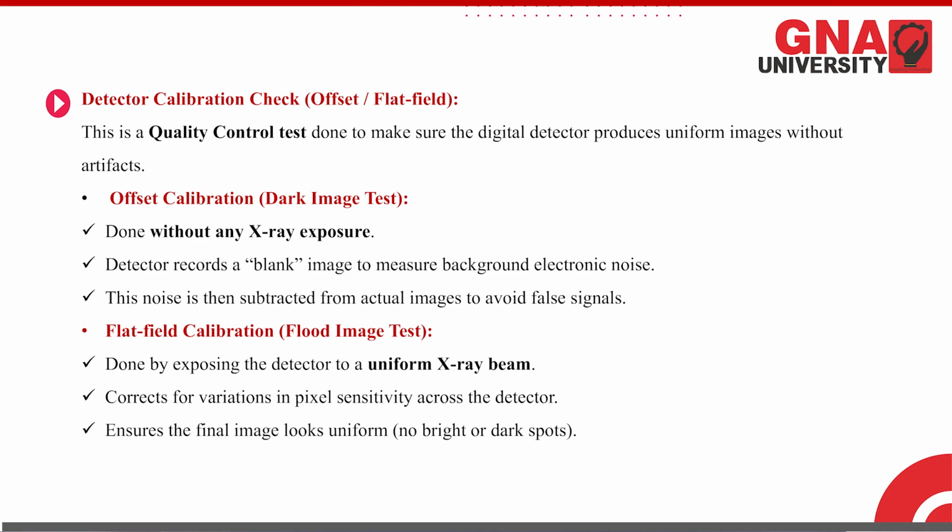When we go for a patient, we will examine the patient. At that time, we will subtract this black image from the actual patient image, so that we can get an image without any background noise, without any detector noise.